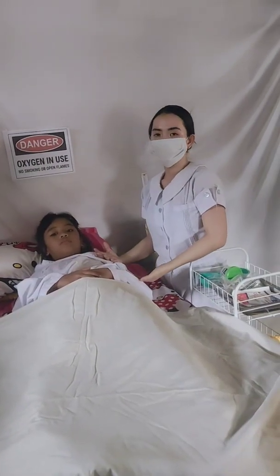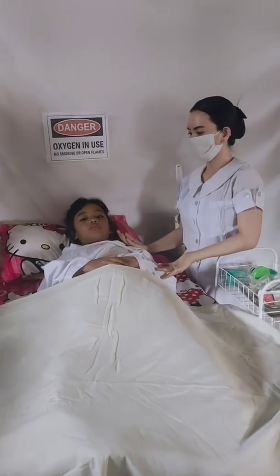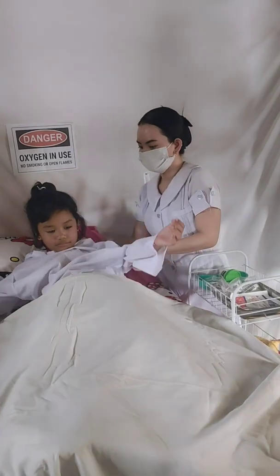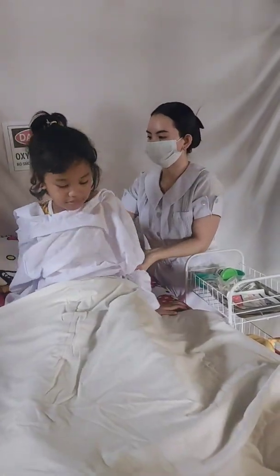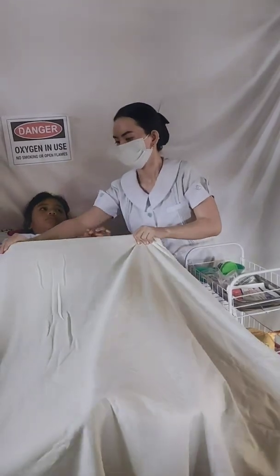After the assessment is the planning. First is assist the client to a semi-Fowler's position if possible. This position permits easier chest breathing. The rationale for doing this position is that it facilitates optimal lung expansion.